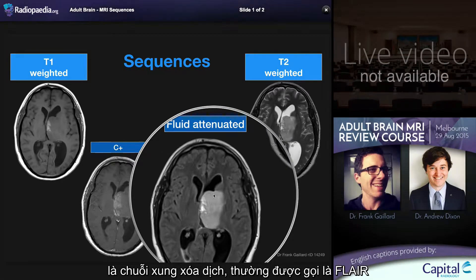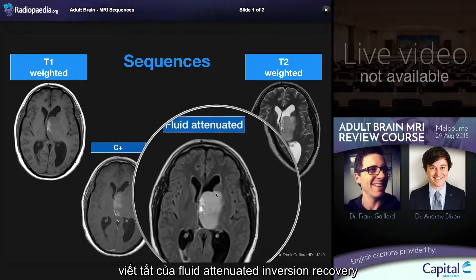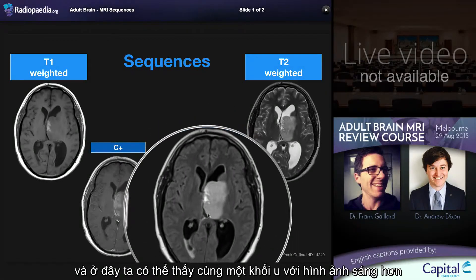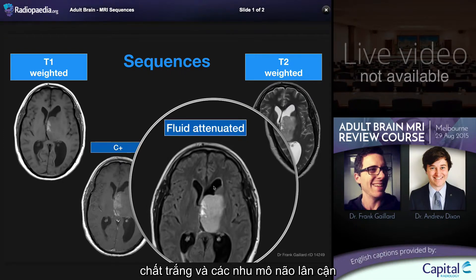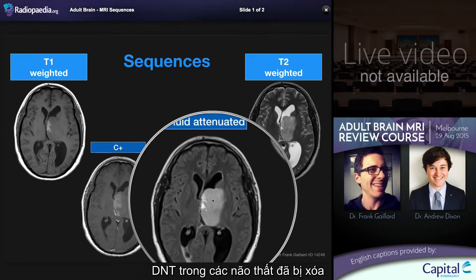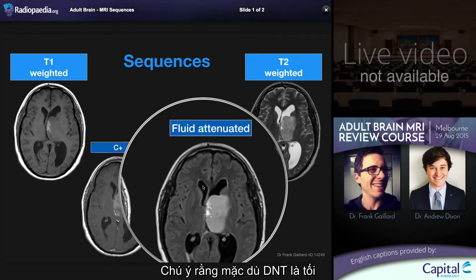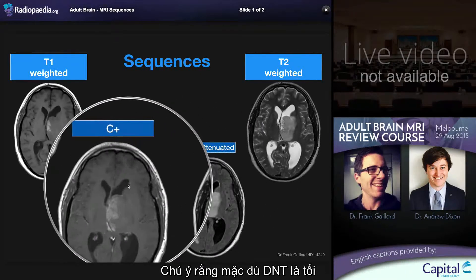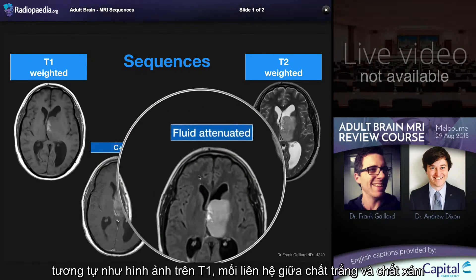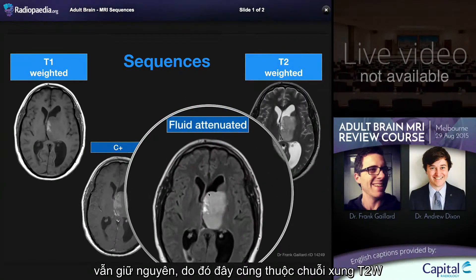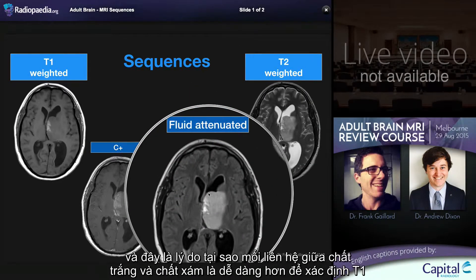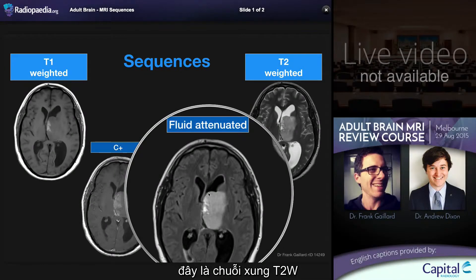The most common modifier for T2 weighted images is fluid attenuation, usually referred to as FLAIR — fluid attenuated inversion recovery. Here we see this same tumor standing out more brightly against the white matter and adjacent brain parenchyma now that the CSF within the ventricles has been attenuated. Note that despite the attenuation of CSF such that it appears dark, similar to T1, the relationship of the white matter to the grey matter has remained that of a T2 weighted sequence. This is why this relationship is the more important and easier way to identify a T1 versus a T2 weighted sequence; otherwise a FLAIR sequence can be mistaken for a T1.